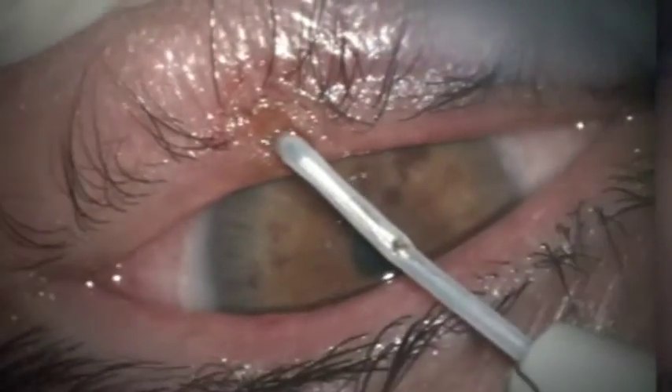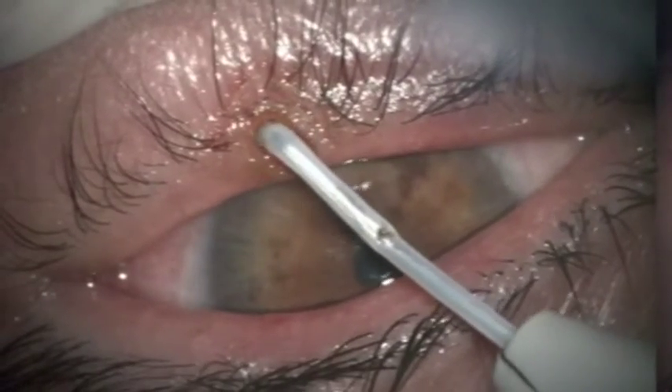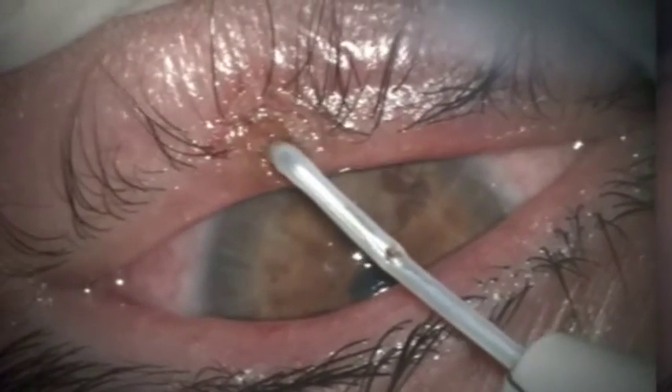Apparently nothing is left there, and I will leave this area raw. It's a small area — it will get covered by growth from the side.